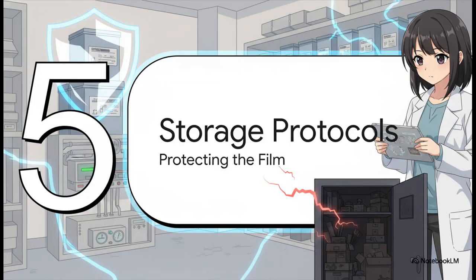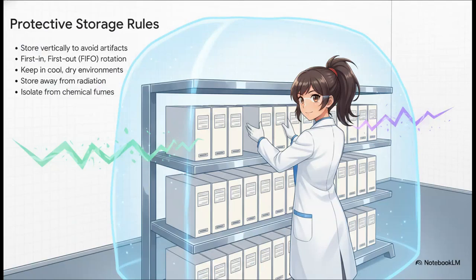Let's pivot to Section 5, Essential Film Storage Protocols. Because we are dealing with a highly sensitive chemical ecosystem, how you store the film before use is a big deal. Strict adherence to storage rules prevents mechanical damage and accidental fogging that could completely ruin a diagnosis.